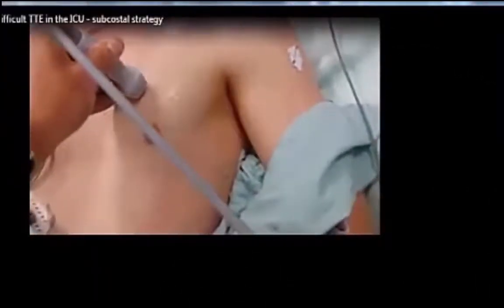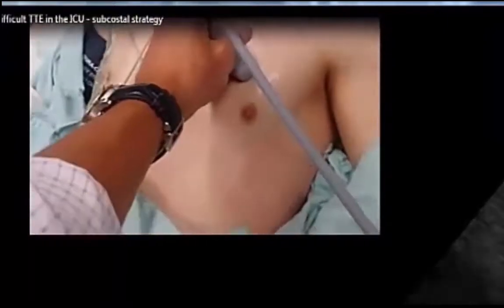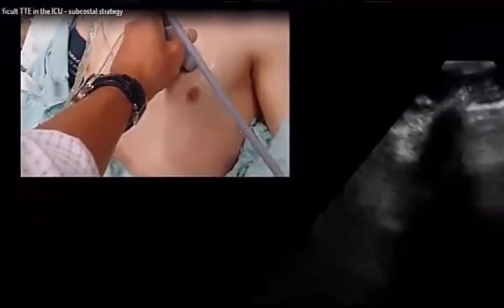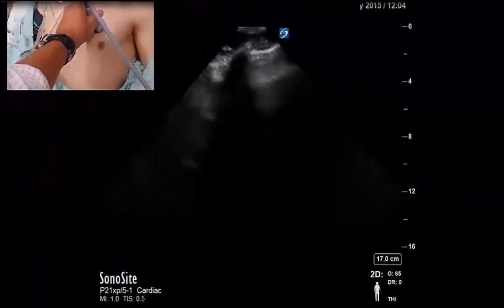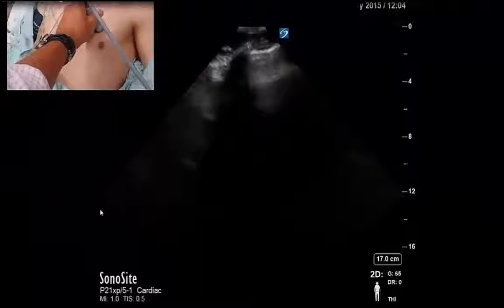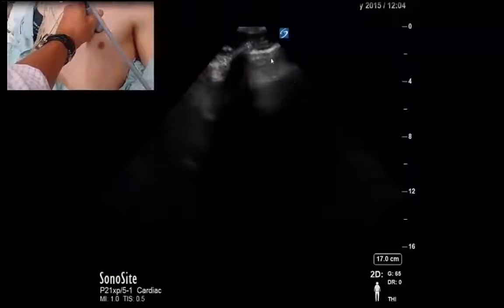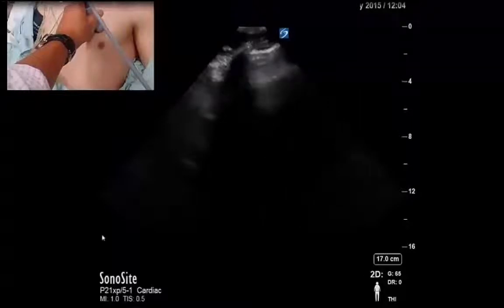We're going to start in the parasternal long axis. My index mark is pointing towards the patient's right shoulder in the third to fourth intercostal space. When the probe is placed on the patient's chest, we see exactly what we don't want to see — lung artifact instead of a heart, and rib shadows. So how do you approach this situation?